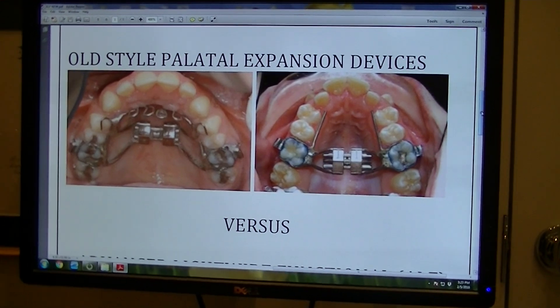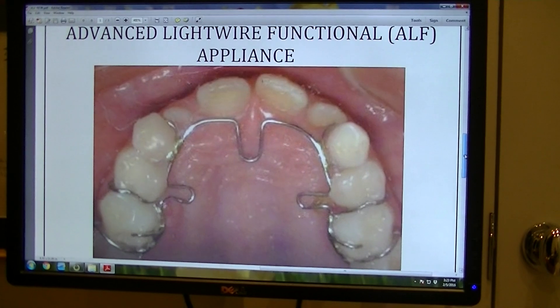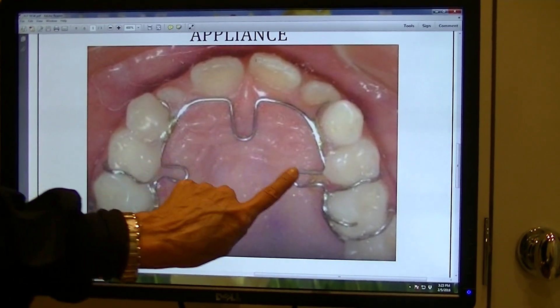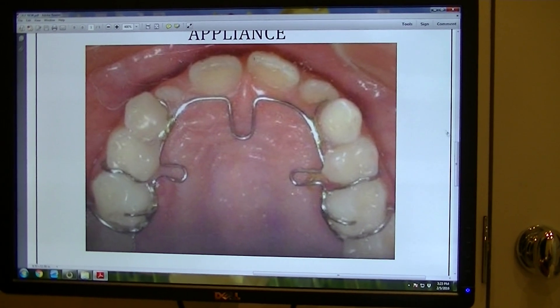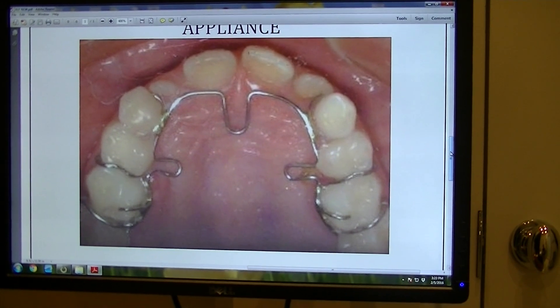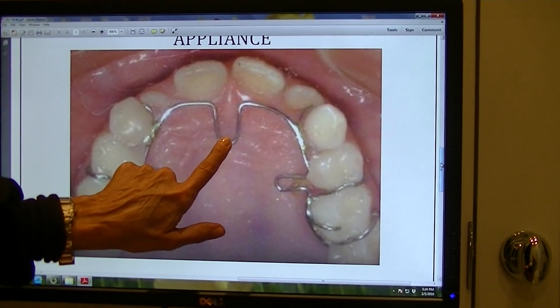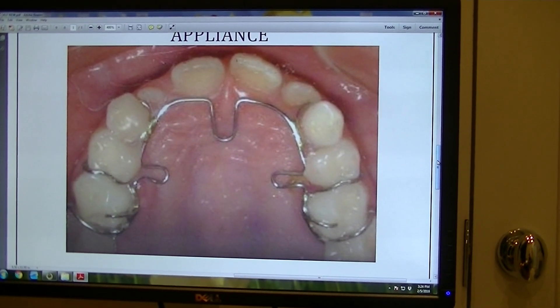The newer expansion device that we're using, called the ALF — which is the Advanced Light Wire Functional appliance — looks like this. It does not cross the roof of the mouth, as you can see. It has a few loops that I use to activate it and it's very unobtrusive and easy for patients to wear. It applies a very light continuous force instead of a heavy force, and it actually encourages proper tongue position by bringing it up to the roof of the mouth as the roof of the mouth is expanding.